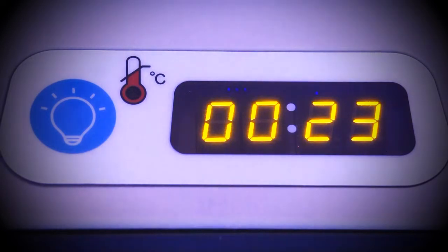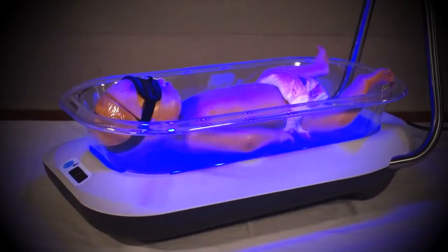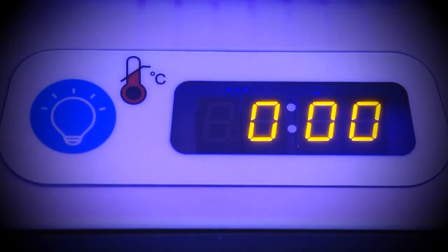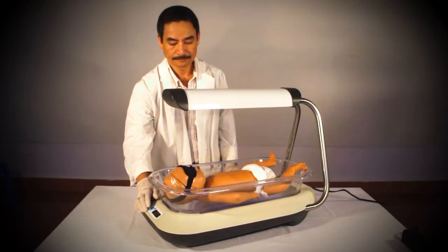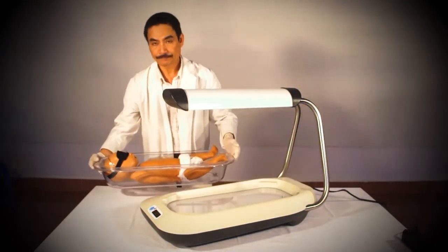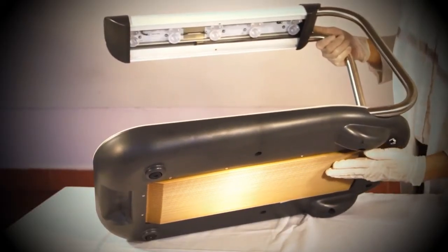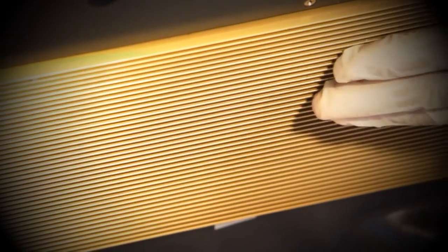After three seconds, the total use number disappears and the display will show the counter for the current treatment session. The device counts up from zero and displays the time in minutes and hours. This counter restarts from zero each time the Firefly is turned off and on. Remember to always place the Firefly on a hard, flat surface so as to avoid overheating the machine.